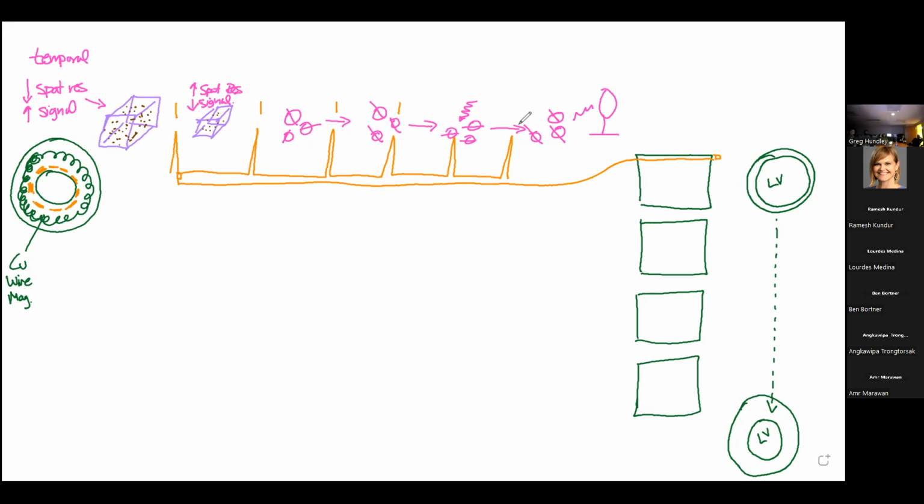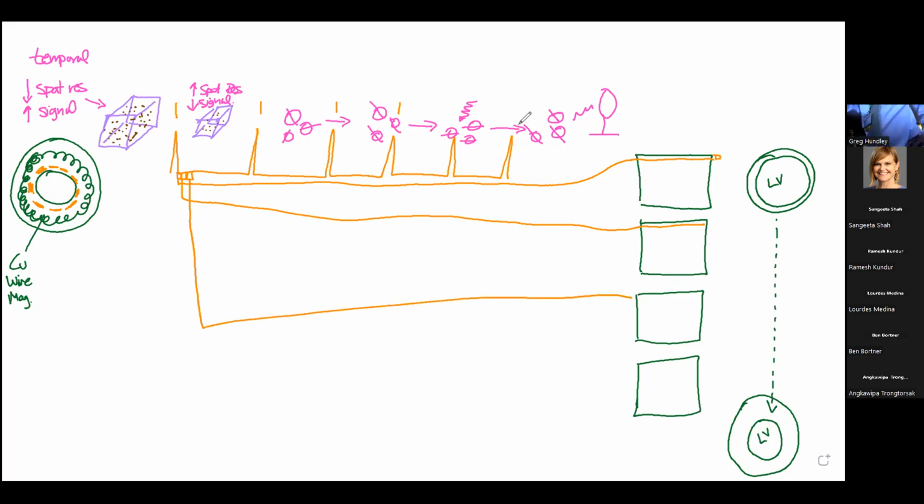And then throughout this QRS complex, for this moment in time, this one comes over and populates this piece of information on that frame. And for this next moment in time, you get the picture here. This comes over and populates this row.